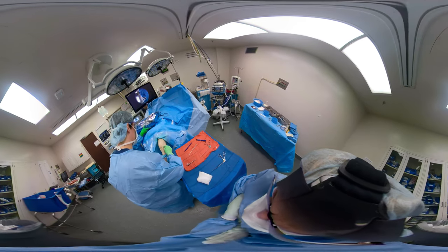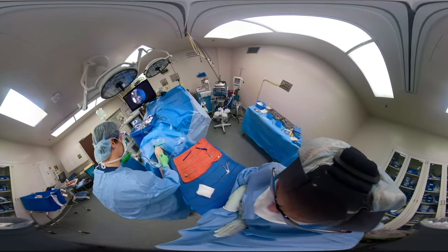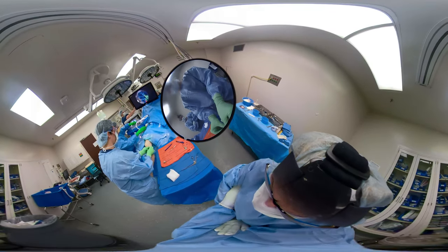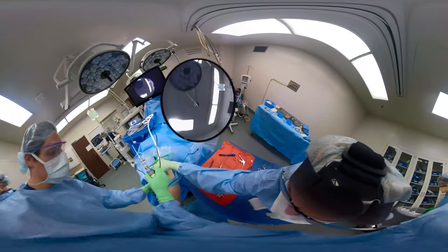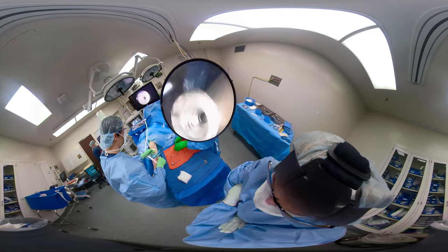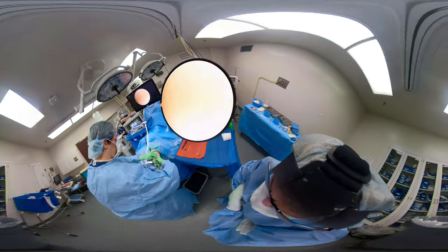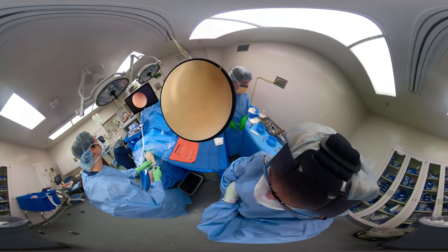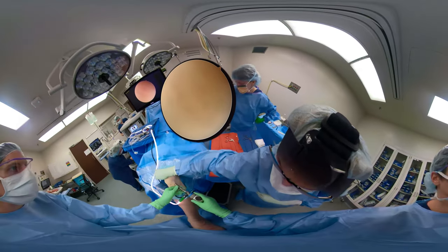Blunt probe, obturator. The blunt obturator and 5.5 cannula are now in the joint. You can milk some fluid out of there if there's any intra-articular effusion or hemarthrosis. Lock the 30-degree scope into the cannula.